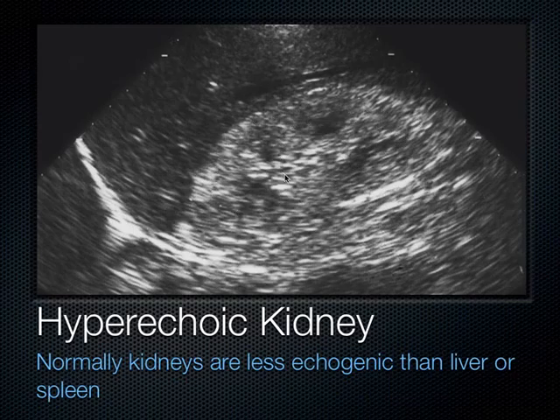Remember the cobblestoning that you saw a few slides back? The tissue looked very hyperechoic, very bright there. And that happens when you have infection. Things get more echo bright, or more hyperechoic.